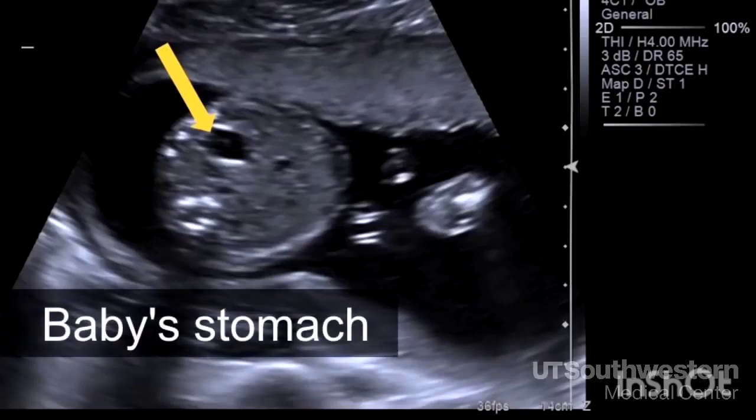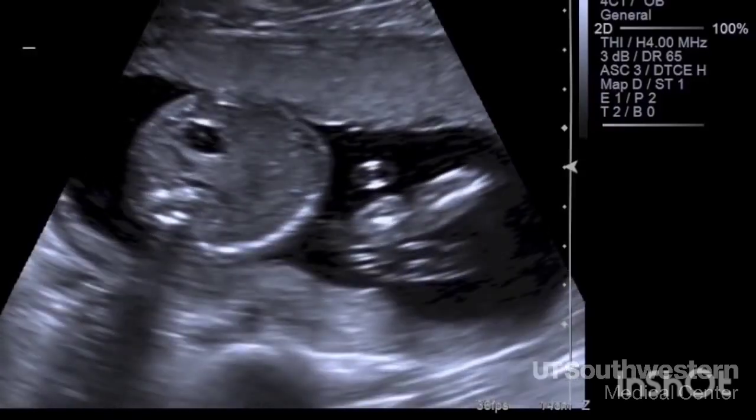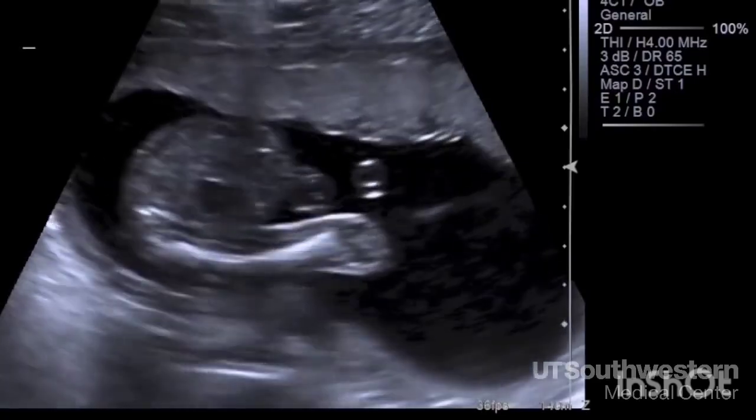The black dot is the baby's stomach, and it shows up as black because it has fluid in it. The fluid is amniotic fluid, which the baby has swallowed. So seeing it there tells me that the baby is swallowing, which is an activity that should be happening. And since the fluid makes it down into the abdomen after the baby swallows, we know it is unlikely that there is a blockage in the baby's esophagus.